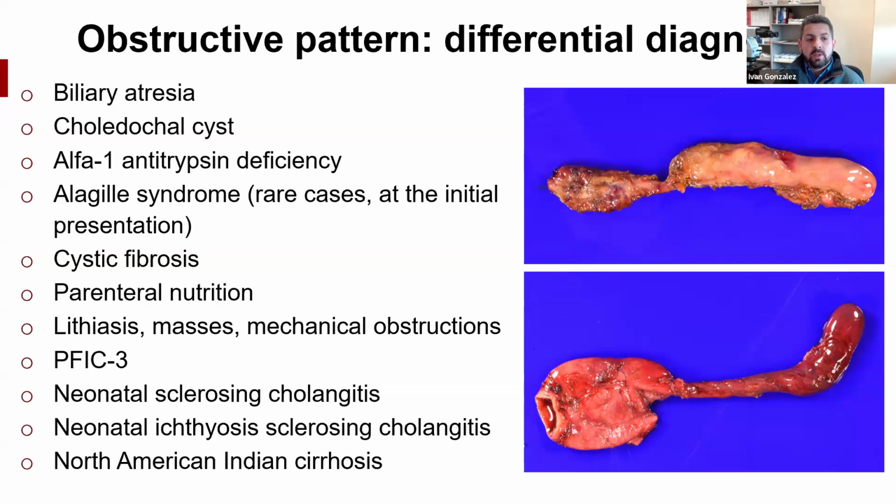So that mucus can accumulate in the small intestine, for instance, in the crypts, and it will look like a acellular, dense eosinophilic mucus. So you can also get it inside the bile ducts. If you see that, that will explain your entire obstructive pattern, and you can also suggest to the clinician the differential diagnosis of cystic fibrosis.